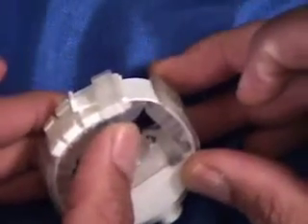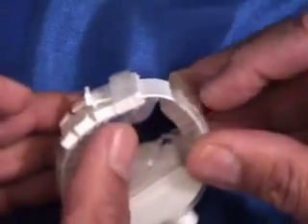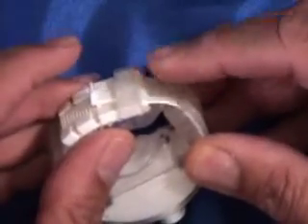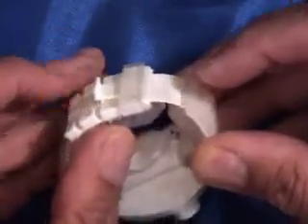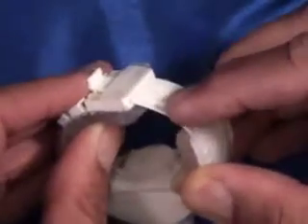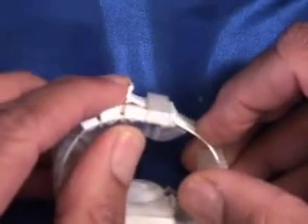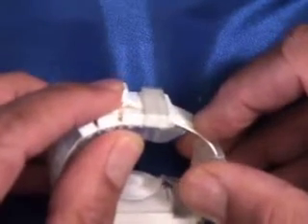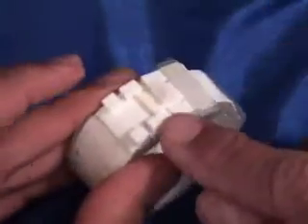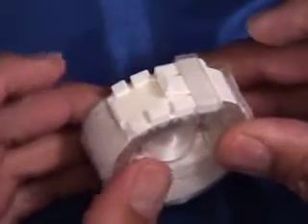Protective tongue in the soft lining. This prevents penile skin from getting trapped between the gate and the strap. The gate that accepts the strap, elevator tab that helps lock the strap in position and secure the device, the guiding rails which keep the strap in position and help it lock.